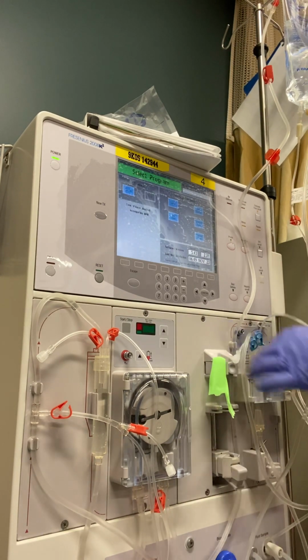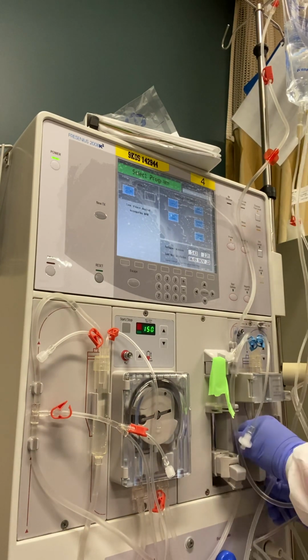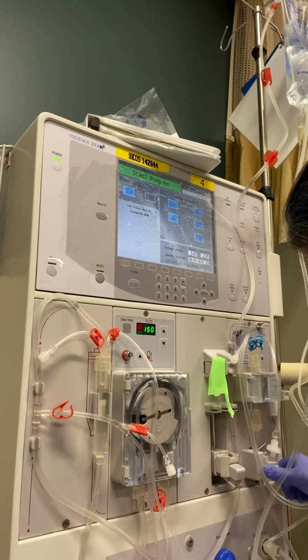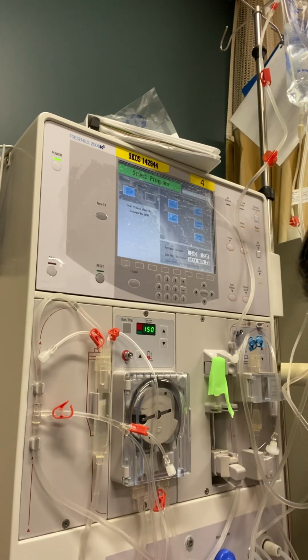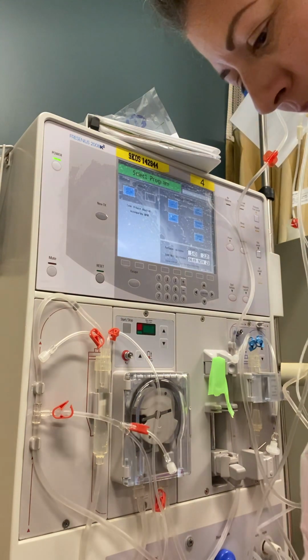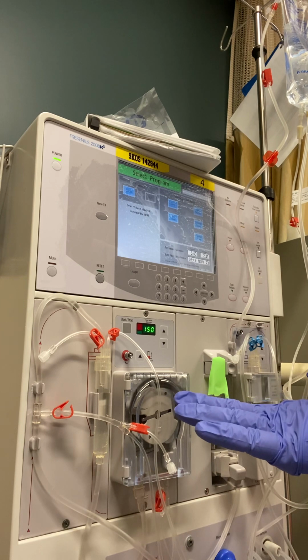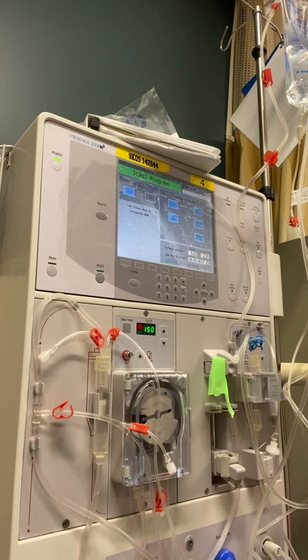Okay. And then I'm going to put the venous tubing in the air detector. Close that. So, at this point, I'm not going to go any farther because I'm not using the baths, so I'm not going to get to the recirculate step or the testing of conductivity or pH. But that is, I'm pretty sure, how you build and prime the machine. I think I did pretty good.